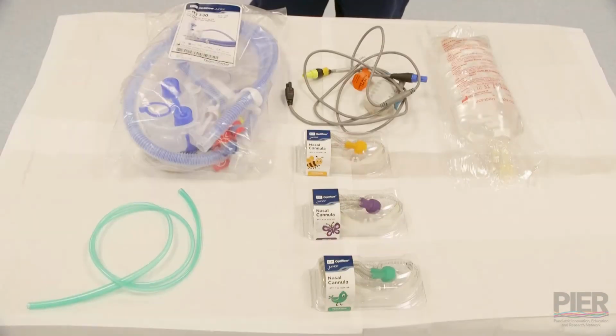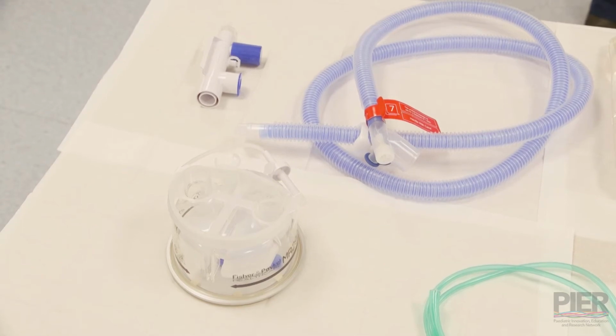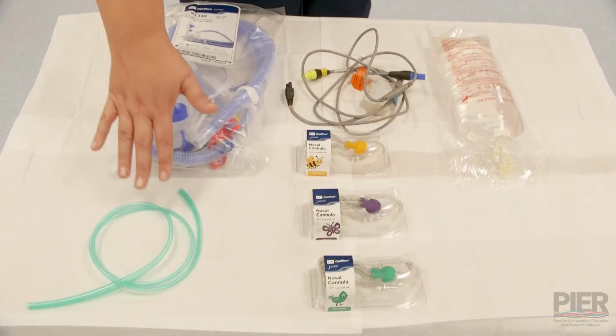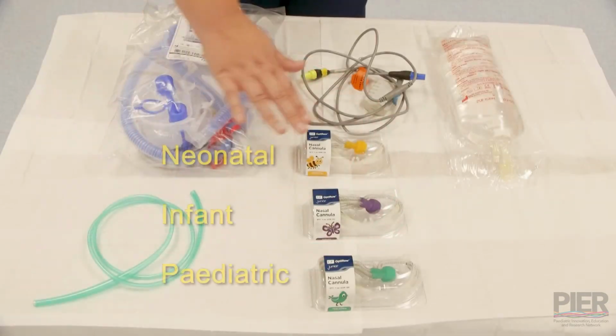So the equipment that we've got on the table is everything that you should need to be able to set this up. So we've got the Optiflow circuit, which comes with everything it requires in the bag. You'll need temperature wires for your humidifier, a bag of sterile water, again for the humidifier, some green oxygen tubing to connect the oxygen into the Optiflow circuit, and then we've got our prongs.